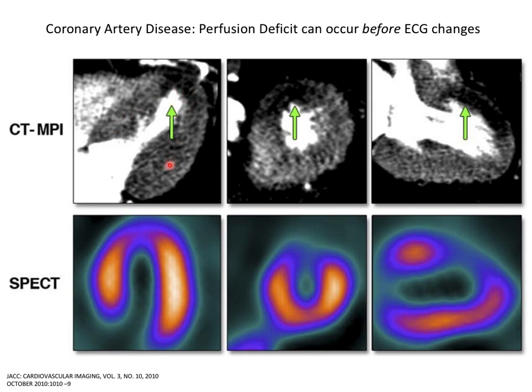These are CT images. Remember, when we take a CT image, we inject contrast into the vein and then take the image sometime later, usually about 10 seconds later. This is the long axis view of the left ventricle. This is the right ventricle chamber here, and this is muscle. This part of the muscle looks a lot darker, right?